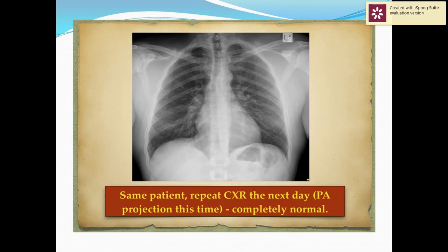Same patient, repeated chest X-ray the next day. This is the posterior anterior view projection at this time, which is completely normal.